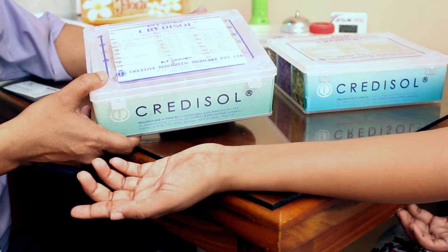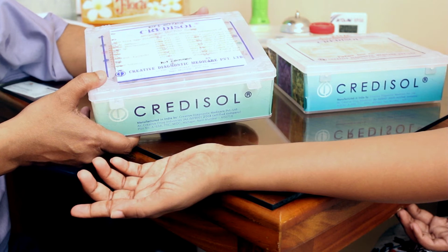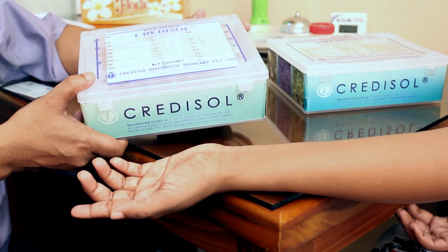So therefore it is important that you request the patient not to take Ayurvedic medicines 5 days prior to the skin prick testing. And then the patient is explained what to expect during the allergy test, how it is done, and what type of reaction you are expecting if the patient is found to be allergic to certain food items or inhalation allergens. So after obtaining consent from the patient to do the test, I will proceed with the test.